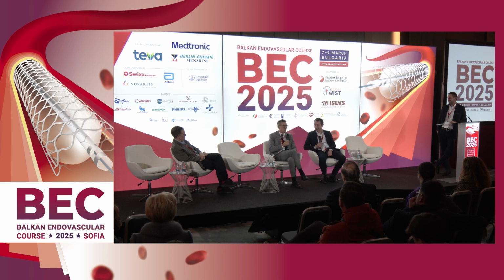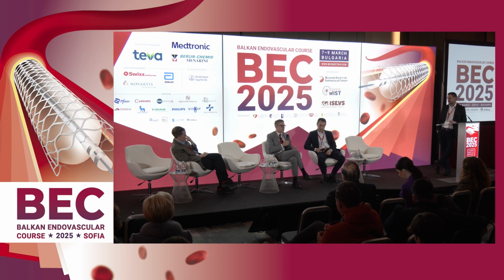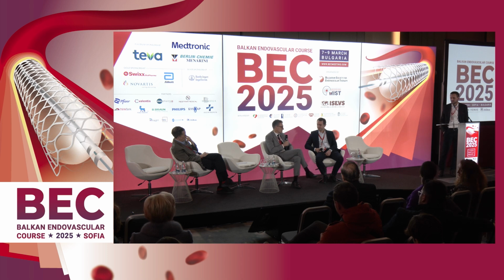In fact, we have several cases in which, on purpose, we have used chimneys and fenestration. So there is no dispute between chimneys and fenestration. Probably the most important thing to emphasize is that we have a plethora of possibilities, and in a typical aortic center, the best way is to have different ways of intervention, because in some patients we definitely need a combination of different endovascular approaches in one and the same patient, or even in some cases combining hybrid, surgical, and so on. We are not against surgical. Of course, we are working together in an excellent way. And many times the final decision depends on the limitations. Absolutely.